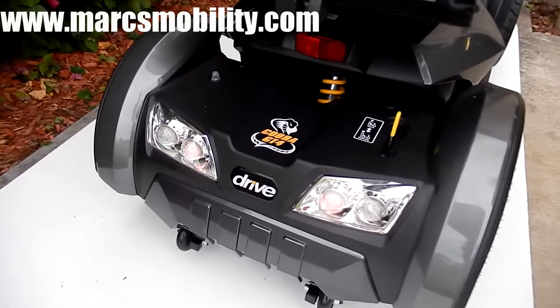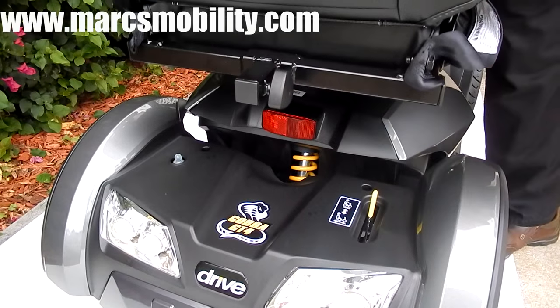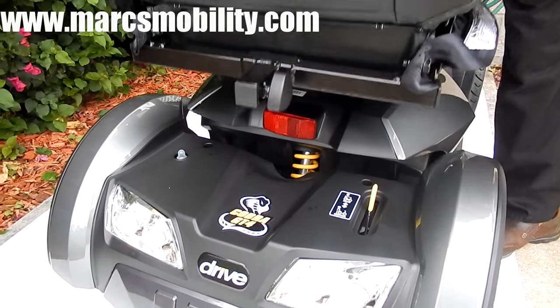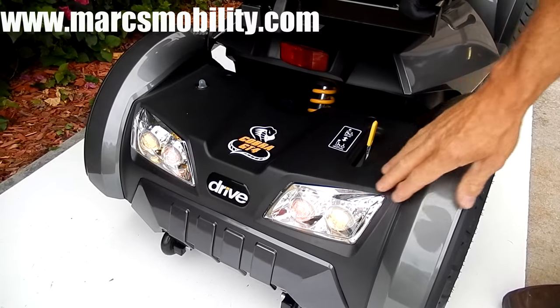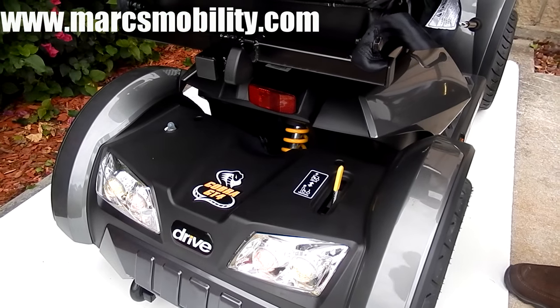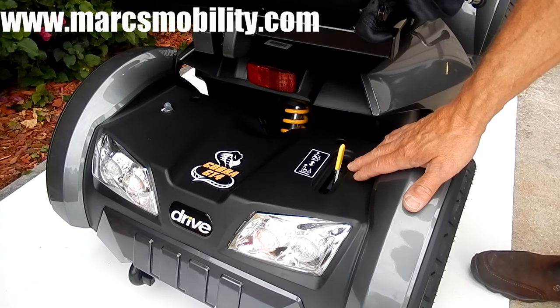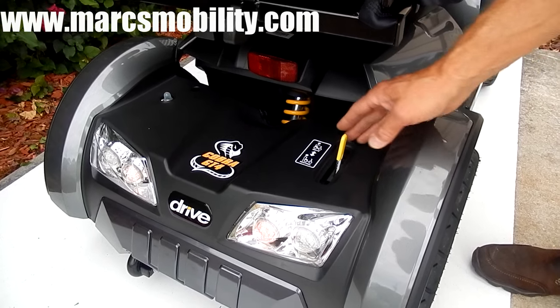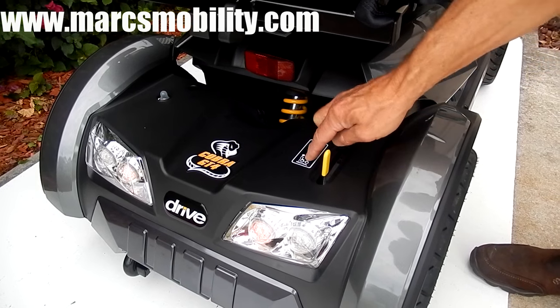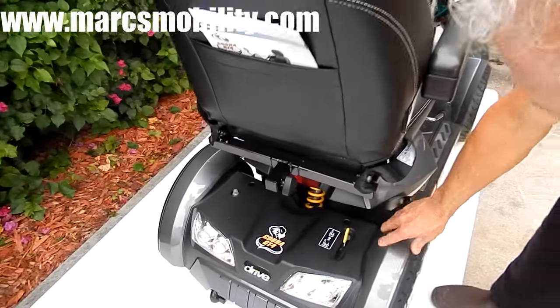It also has blinking lights front and back. As you can see in the back, there's your suspension back there. If I push the seat down, you can see the suspension on the seat — it's almost like driving an 18-wheeler. These are your headlights and your tail lights. You also have a neutral here, so if your scooter stopped and you needed to push it home, push it to neutral right here on this lever, and you can push it. Push it back, and you're back in gear.